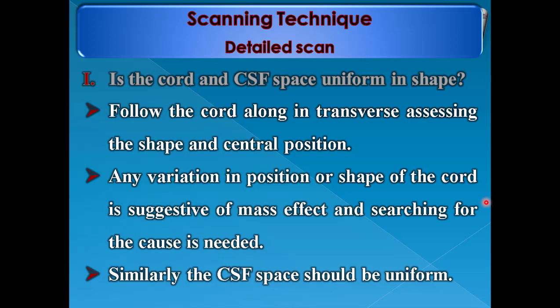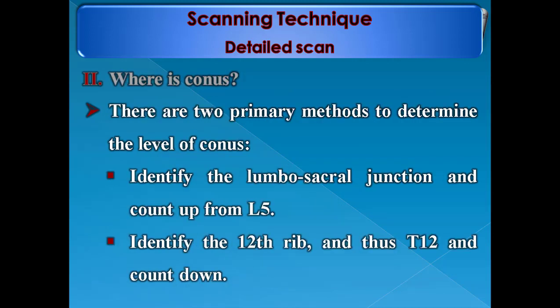Similarly, the CSF space should be uniform. The second question is: where is the conus? There are two primary methods to determine the level of the conus. The first is to identify the lumbosacral junction and count up from L5. The second is to identify the 12th rib and thus the T12 vertebra and count down.